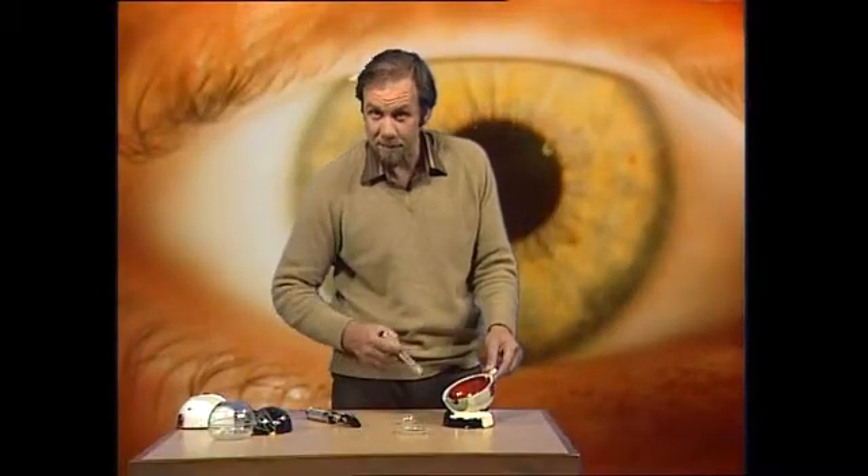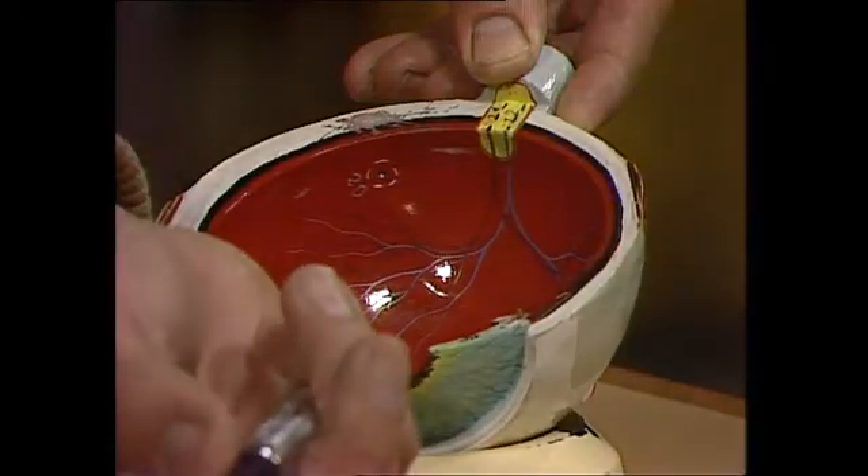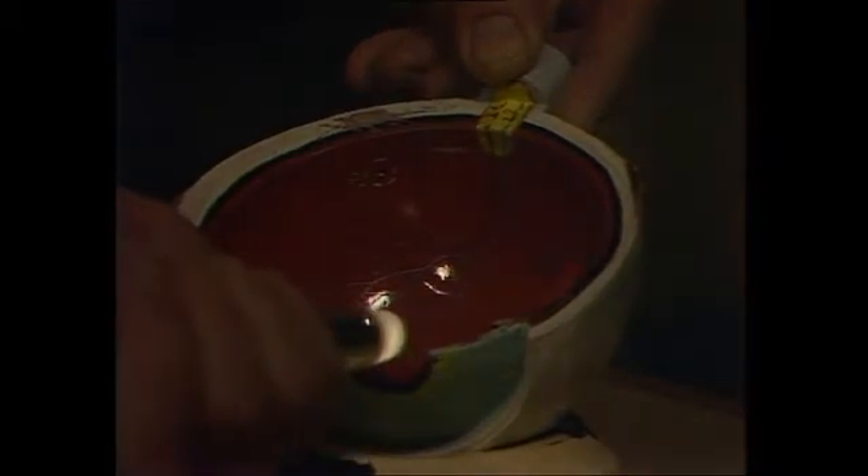And if he gets it right, the light inside the ophthalmoscope — which is powered by batteries and sends a light beam through a prism — directs that light beam through your lens onto the back of the eyeball. And you can see it picks up different things. There are some blood vessels. Over here is the place where the nerve leaves the eyeball. Just there is the most sensitive spot in the eye. And by hunting around, looking through your pupil, he can examine parts of your eyeball and see if there's anything wrong.